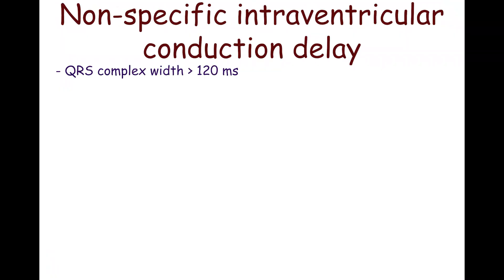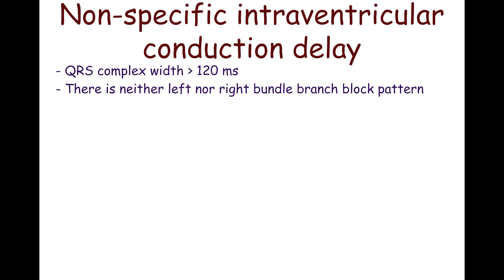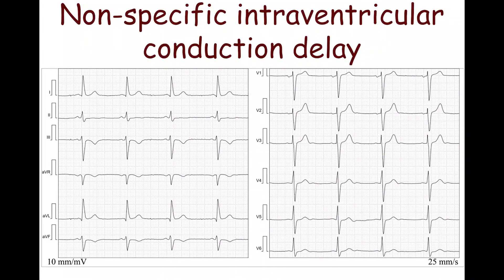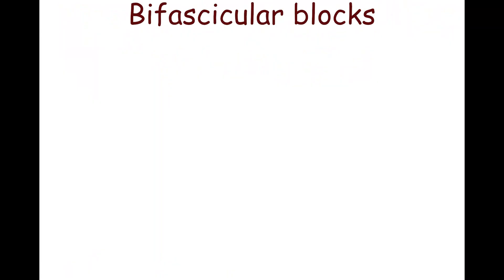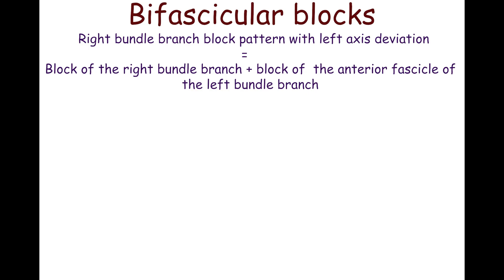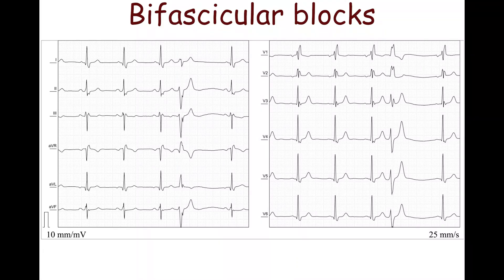If the QRS complexes are wide — more than 120 ms — but show a pattern of neither left nor right bundle branch block, a non-specific intraventricular conduction delay is diagnosed. This ECG shows a pattern of left anterior fascicular block, but QRS complexes are 140 ms in width. The combination of right bundle branch block pattern with left axis deviation belongs to bifascicular blocks; in this case, both the right bundle branch and the anterior fascicle of the left bundle branch are blocked. On this ECG, right bundle branch block pattern is combined with left axis deviation, with a QRS complex width of 140 ms.